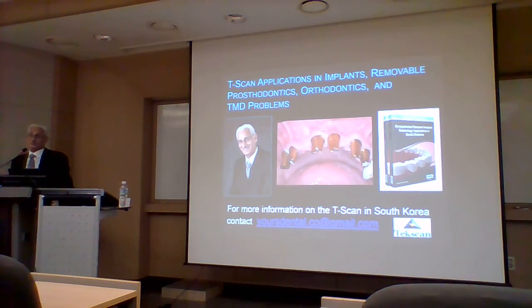Yes. So, as you can see, having access to these technologies makes occlusion much more of a science than a subjective art. And that is how we have learned to practice using these amazing technologies that you guys now have access to. So I hope you take the time to learn about them and use them in your prosthodontic residency.